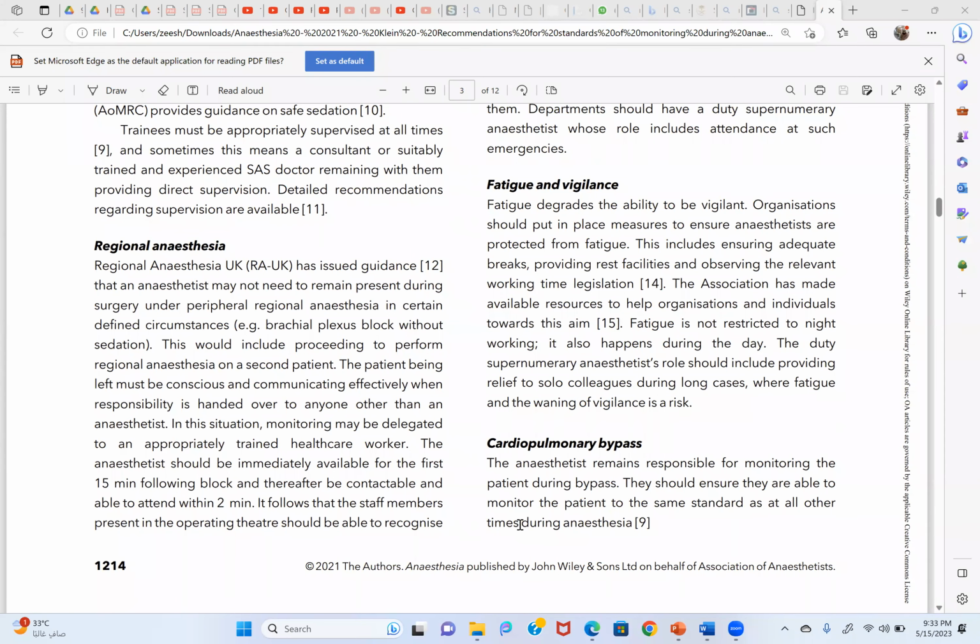It will tell you about the airway. Why is it important? Can anyone tell why it is important, rather than pulse oximeter alone? Because you have put a pulse oximeter and the patient is breathing spontaneously. Why do you still want to have end-tidal CO2? Can anyone tell?